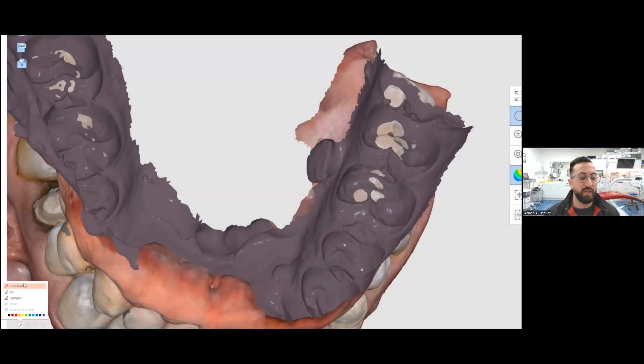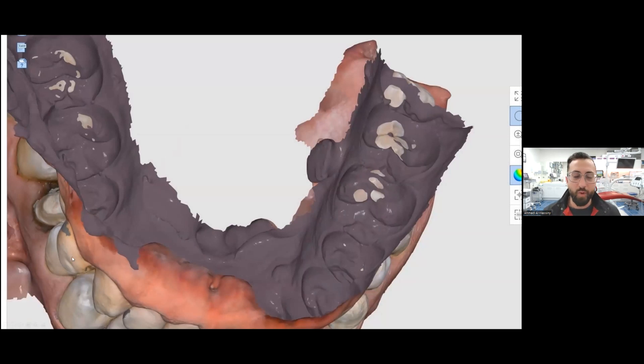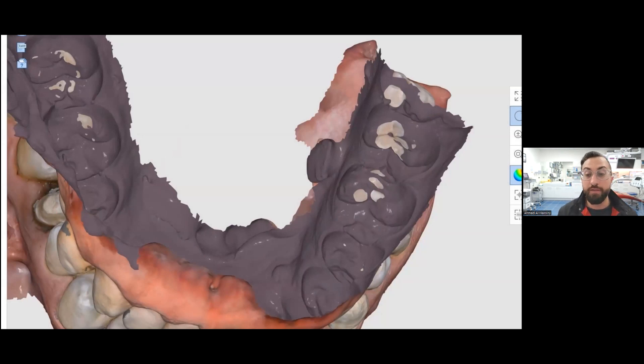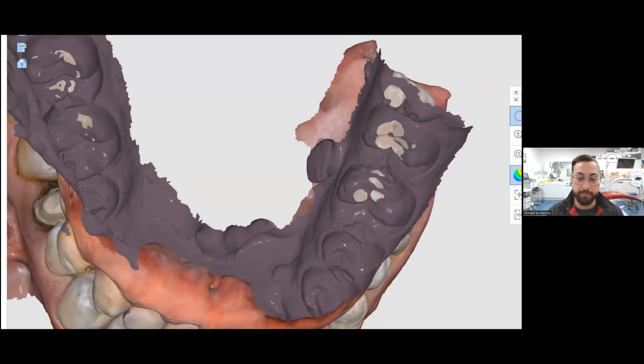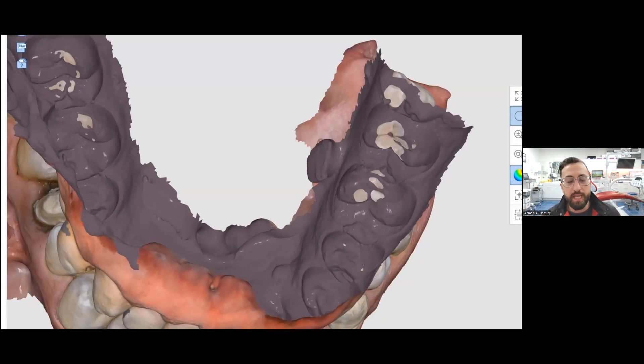And you're wondering, why does the scanner do this? Why is there so many intersections? This is obviously not real life, because the patient's teeth don't magically go through each other. There's a lot of theories why this happens.